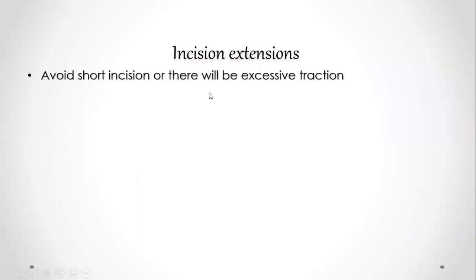So what about extension? Now you start incising with your blade, and you should avoid a short incision, as we see, because there will be excessive traction. Do not do that. With short incisions, you may have to interfere with a jig.